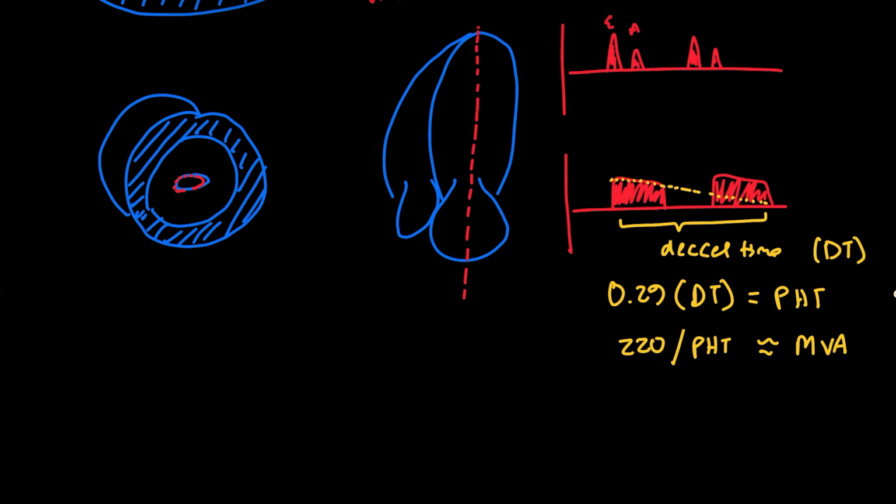Now, I'll mention right after you do a procedure to the mitral valve, like if you balloon a stiff valve open or there's other procedures, then this is less accurate. But in a stable system where there's not rapid changes to the valve and to the hemodynamics, then this can be used. So that's how we estimate the valve area with pressure half time. Of course, we could also just take the area under here, and we could get a mean gradient from that. Mean pressure gradient. I'll draw a line to denote mean pressure gradient.